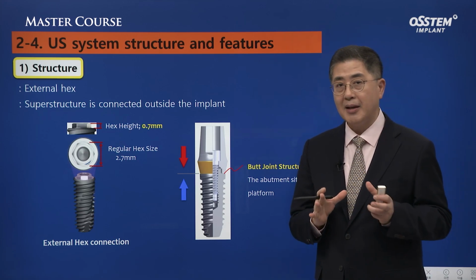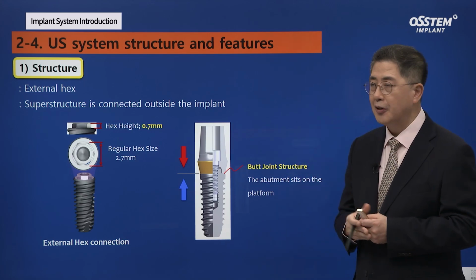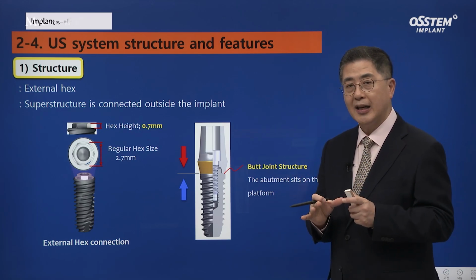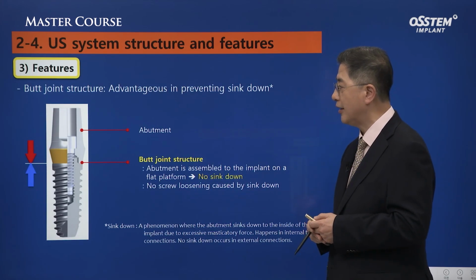I used to use this kind of implant primarily, but even after 20 years, it does not have that many disadvantages. These days, the trend is to place the implant deeper considering the simplicity of surgery and aesthetics. Hence, it is used less these days.